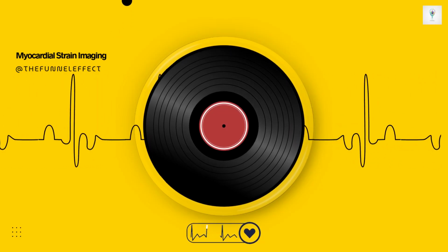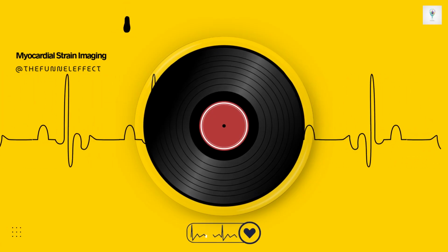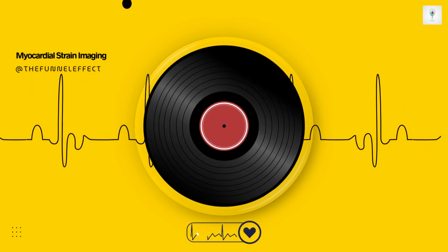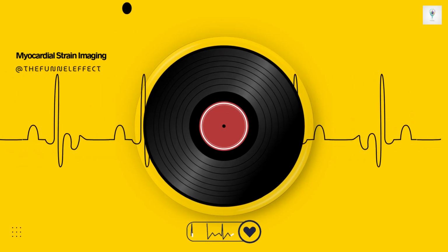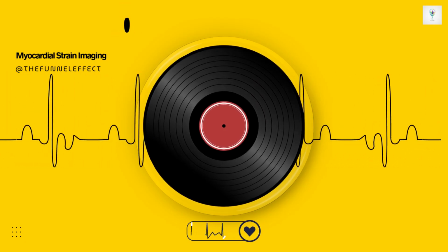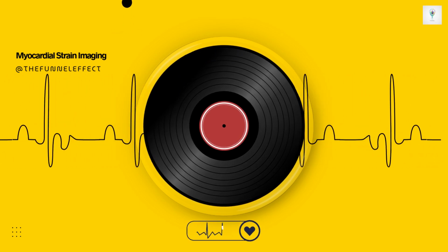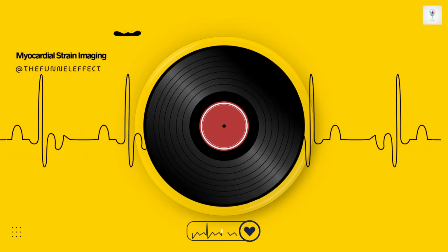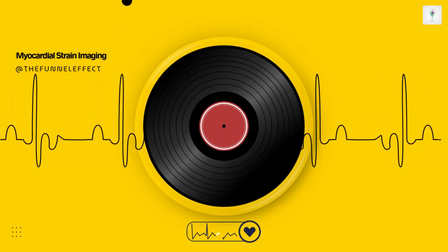Exactly. But if there's disease like scarring or ischemia, some segments might contract much earlier or much later than others. This heterogeneity in the timing of contraction creates electrical instability. And mechanical dispersion quantifies this timing difference. Precisely. It's calculated as the standard deviation, SD, of the time it takes for each individual LV segment to reach its peak shortening strain, measured from a common starting point, usually the Q wave on the ECG. So a bigger standard deviation means more variation, more dispersion in timing. Correct. A large SD indicates high heterogeneity or dysynchrony in the contraction timing across the ventricle.